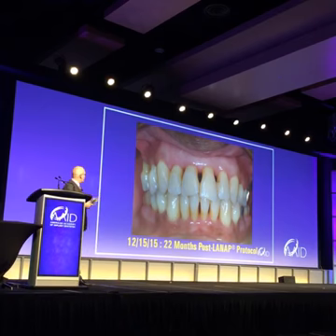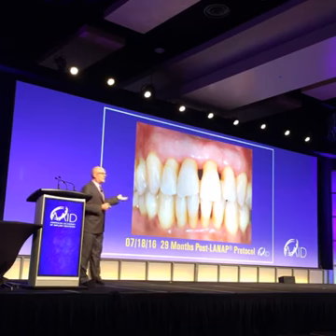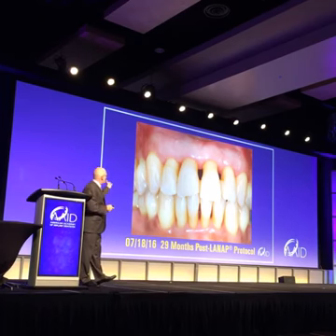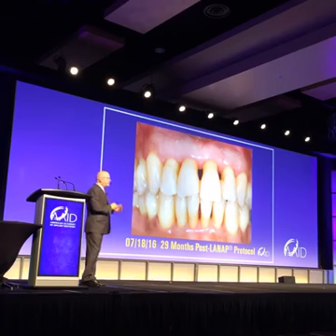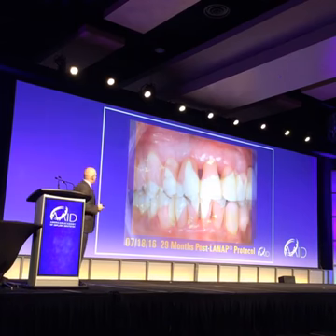Here it is 22 months later. Here he is 29 months later. I just saw him on Monday. He loves his teeth. I changed his splint to an internal splint on the lingual. And he's looking great. Inflammation control, fantastic. I don't think there's another procedure that I can do, or anyone can do, to get inflammation control like this.